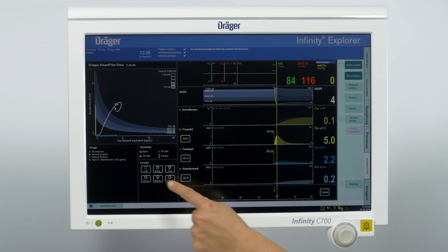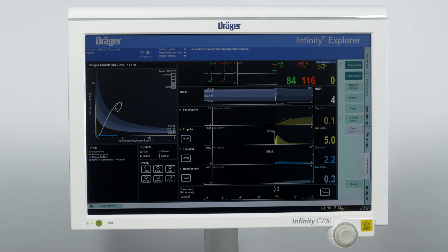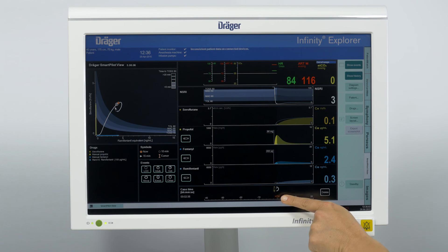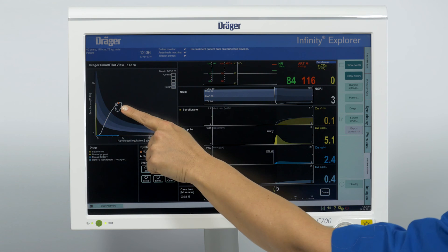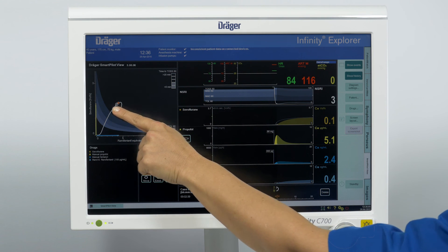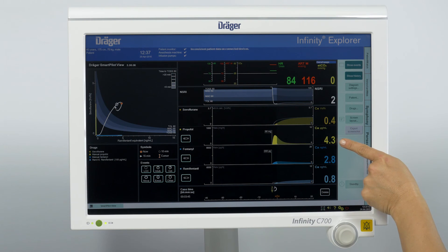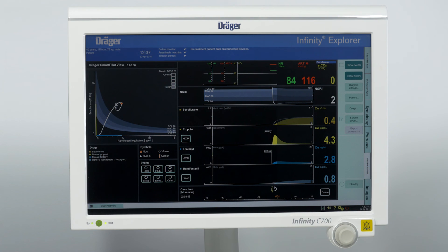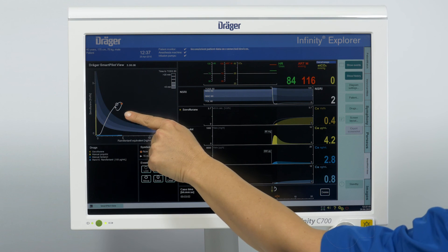To mark the event of intubation, the respective marker is set. You can see the marker in the time-based and in the two-dimensional display. You can see that the given bolus of propofol is metabolized, and therefore the effect site concentration of hypnotics is decreasing, although sevoflurane is not changed.